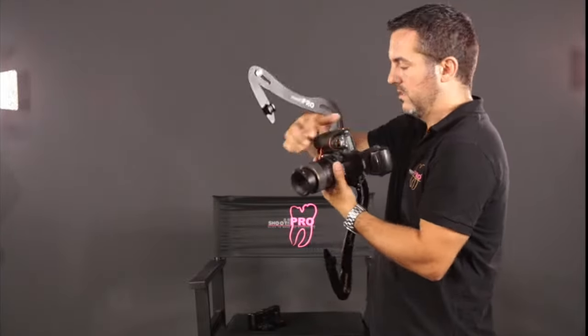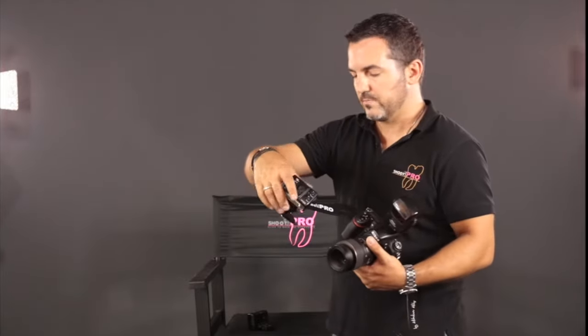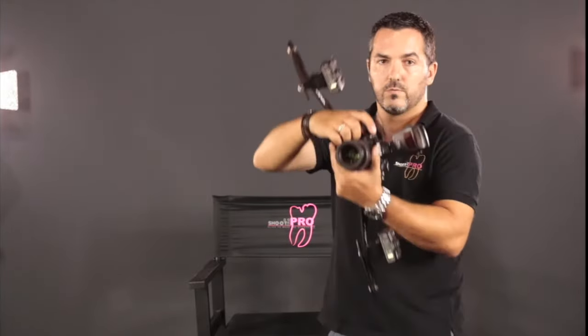It looks like a bow, not anymore like a molar. Then we are putting on the flashes. And that's it — we are ready to shoot.